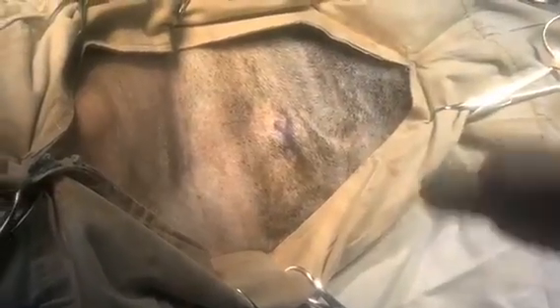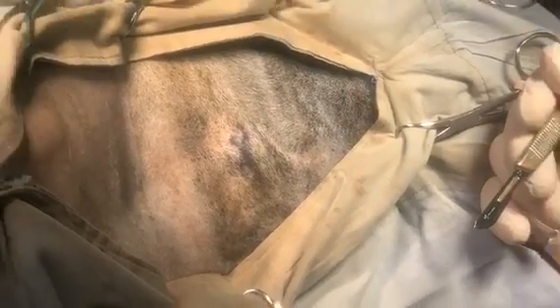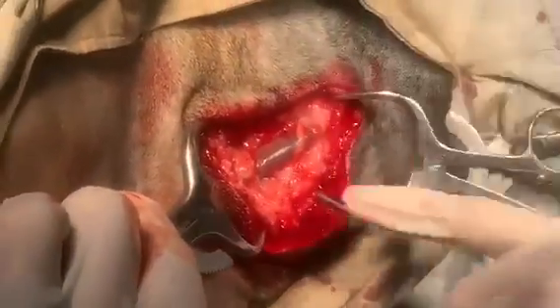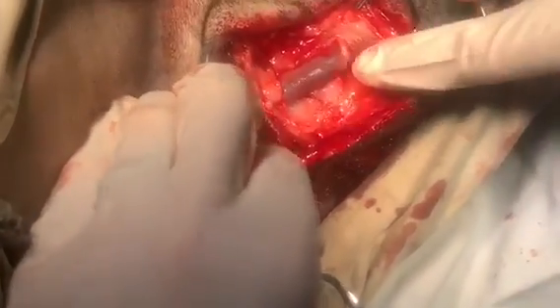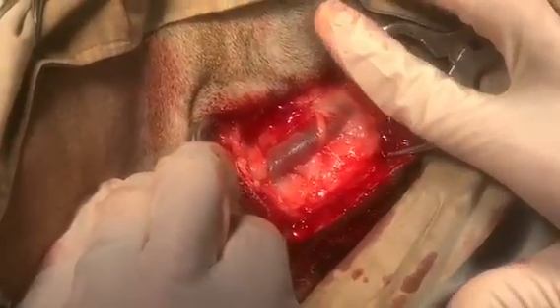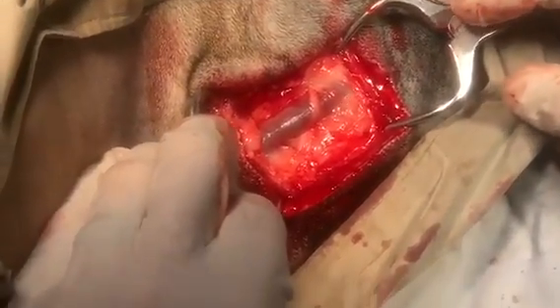There's our marked X from earlier. His head is facing this way, and we're going to make an incision right over the jugular and dissect down to it. As you can see, we've exposed down to the jugular vein, which is very prominent. We will dissect this out, ligate it proximally with a hemostat temporarily, and then make an incision into it to start the procedure.